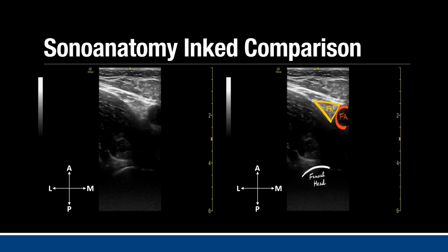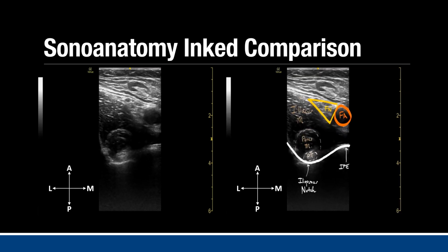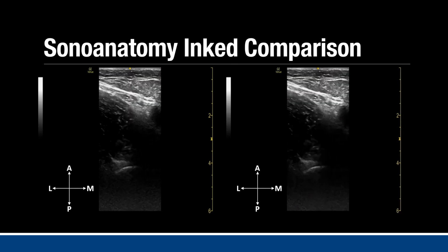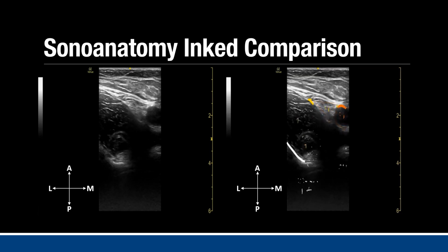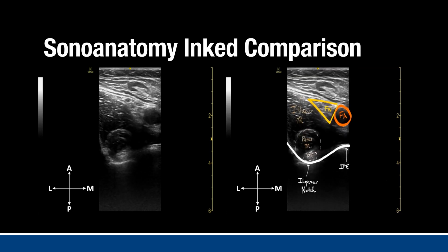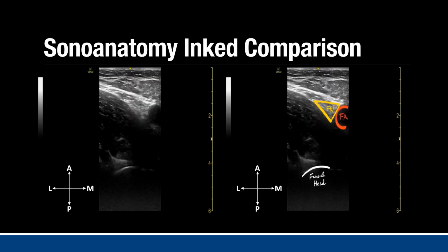Here is a side-by-side comparison of the relevant sonoanatomy of the PENG block. On the right is a labeled version for easier identification as compared to the left, which is unlabeled. I would like for you to familiarize yourself with what you should be viewing to adequately perform this block.